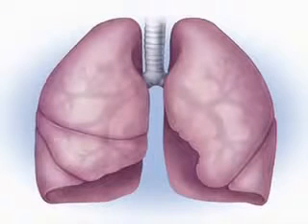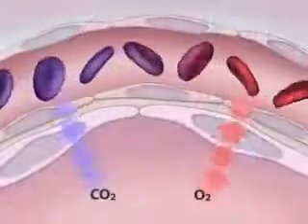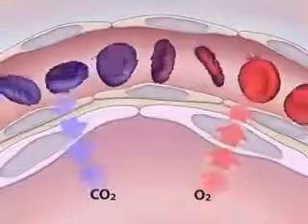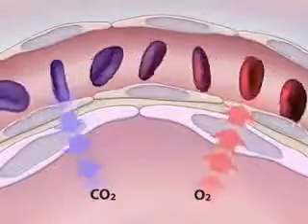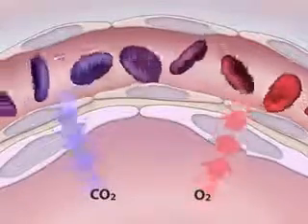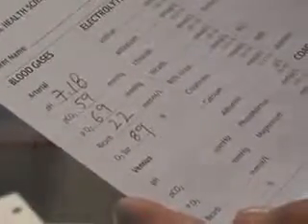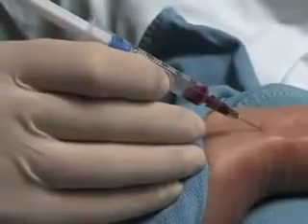Arterial blood gas analysis provides useful information regarding respiratory and metabolic pathology. The partial pressure of carbon dioxide, bicarbonate concentrations, and pH values will assist in diagnosing the presence of primary or mixed respiratory and metabolic acidoses or alkaloses. The partial pressure of oxygen will reveal abnormalities in blood oxygen content and the presence of hypoxemia. With the appropriate technique, radial arterial puncture for arterial blood gas analysis is a skill easily mastered by medical trainees.